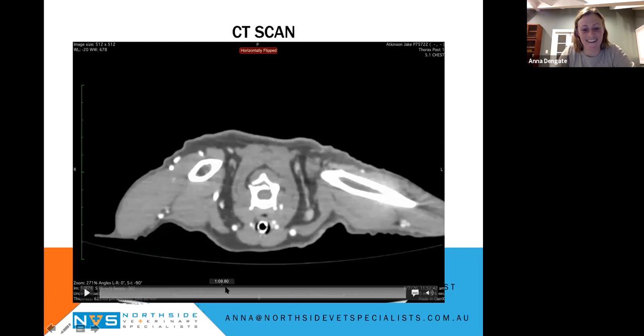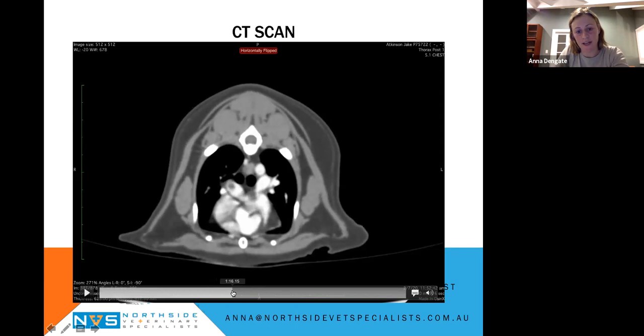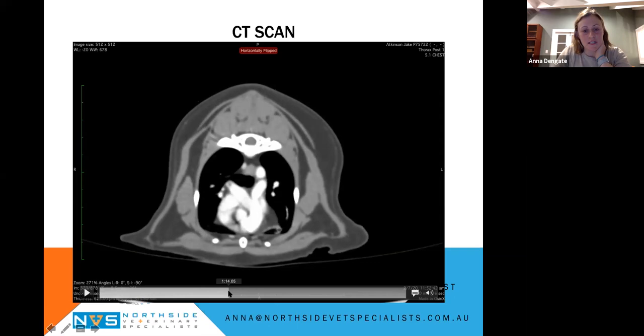So what I want to show you is in this pulmonary artery here, so the right main pulmonary artery. If you follow that, we come down into the pulmonary outflow tract here, branching off into left and right main stem pulmonary arteries. And in the lumen of this pulmonary artery, have a look at this PTE, the clot that's stuck in that vessel. It's absolutely huge. So that clot is essentially almost completely occluding blood flow to the right lung.